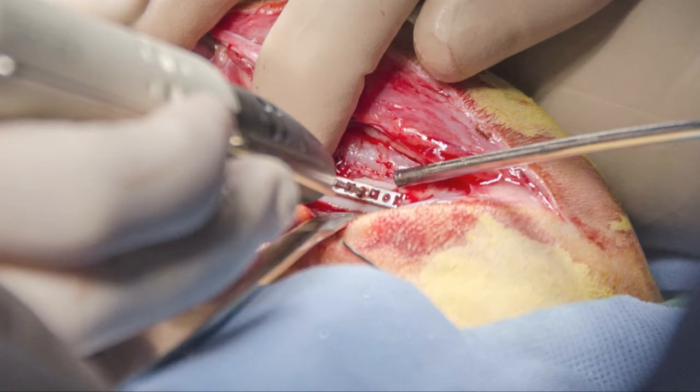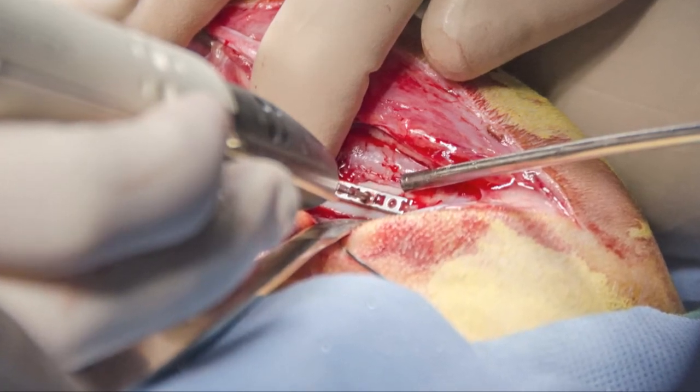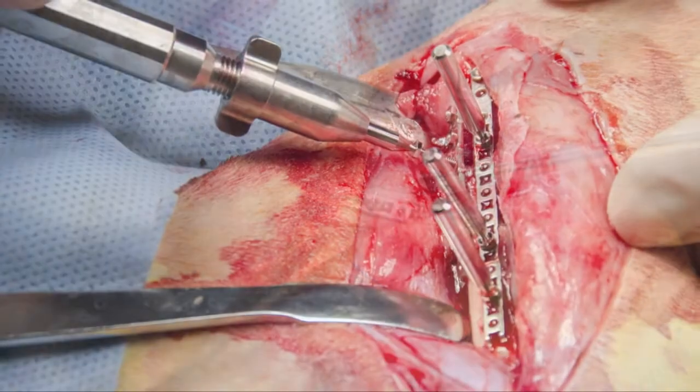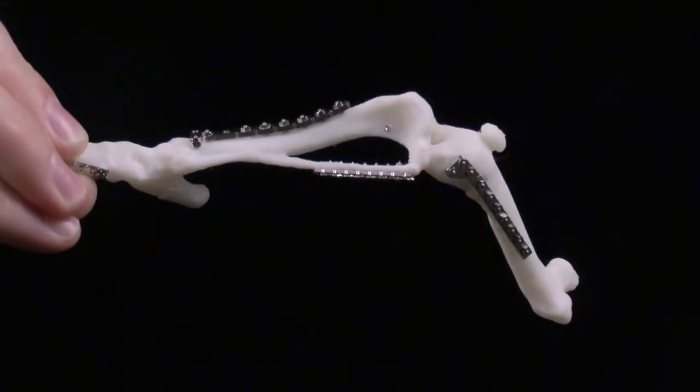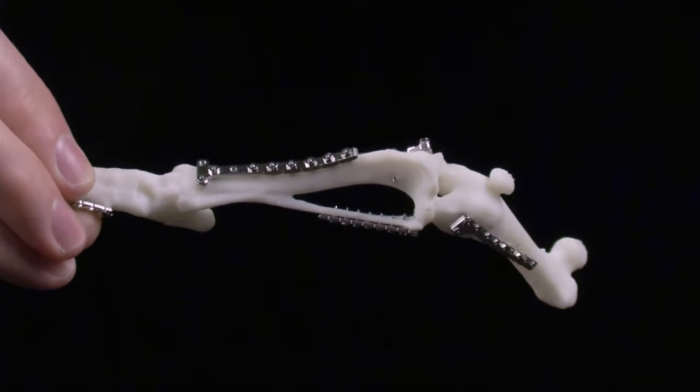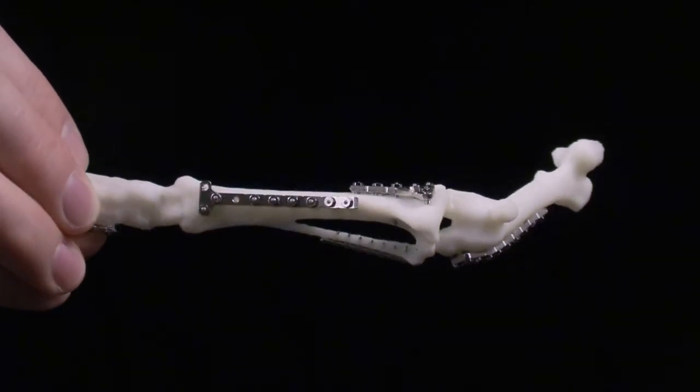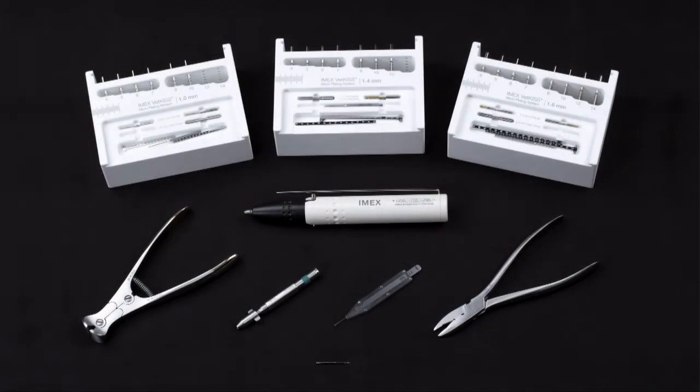The VetKiss micro bone plating system is a veterinary locking plate osteosynthesis system designed for very small bones. A separate tutorial has introduced the VetKiss or keep it simple surgeon concept, as well as the implants and instruments.